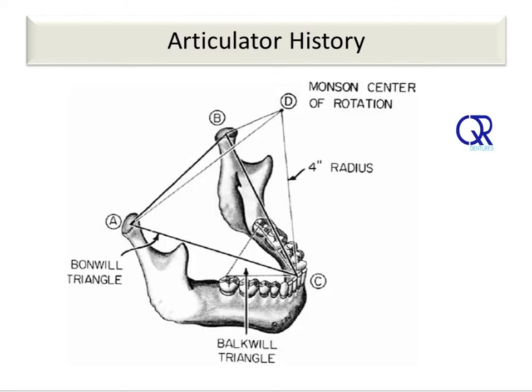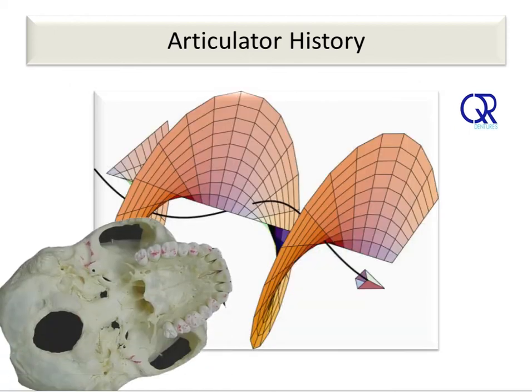As we go through more of the principles of the secure denture system, it will challenge more of the established concepts. We do not believe there are any geometric angles in the human jaws and joints, and we do not believe that both sides of the face operate in the same way during function. We do accept there are compensating curves, but they cannot be described as 4-inch radius curves. In fact, they are described as a parabolic helix, which is a curved curve. This will be covered more in other secure presentations.